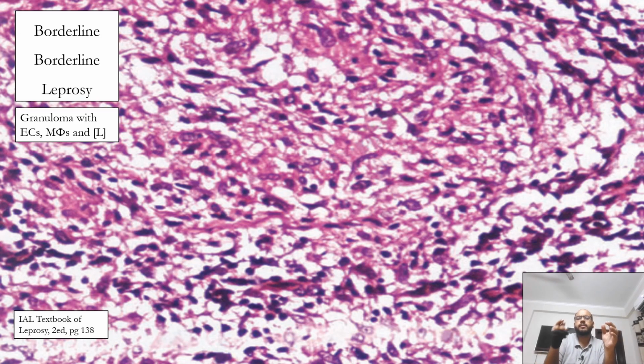Now look at this. Just spend a few seconds and look at this picture. And you will see a lot of empty spaces in between. Are you looking at these empty spaces? This is because this is a case of BB leprosy in type 1 reaction. Remember, BB leprosy is the most unstable form of leprosy. And either it goes towards the tuberculoid pole or it goes towards the lepromatous pole.